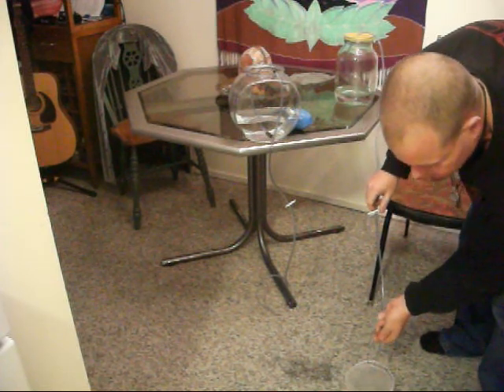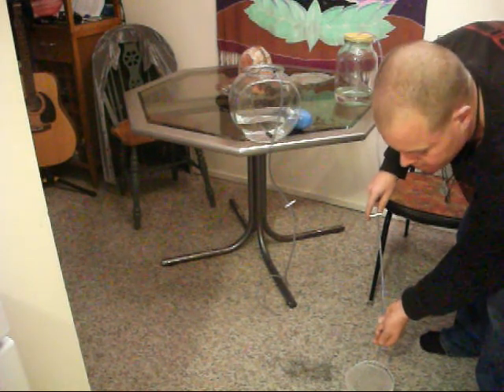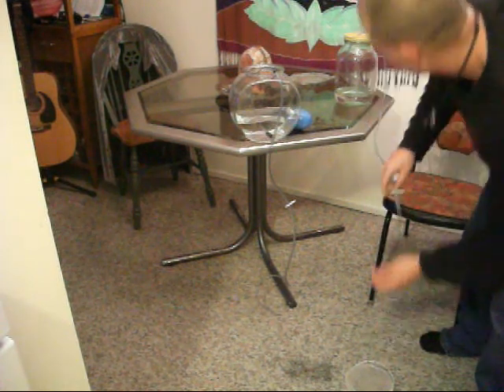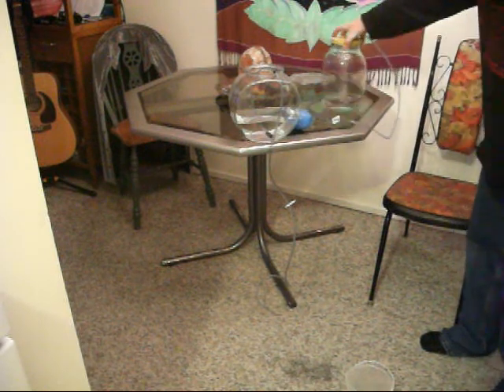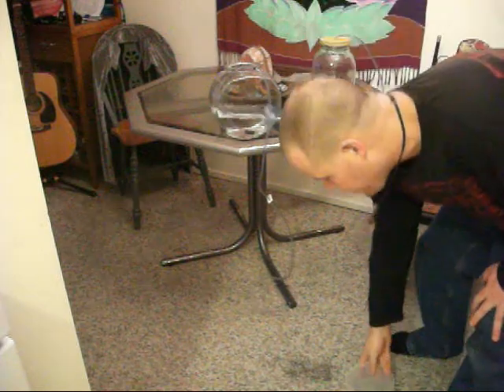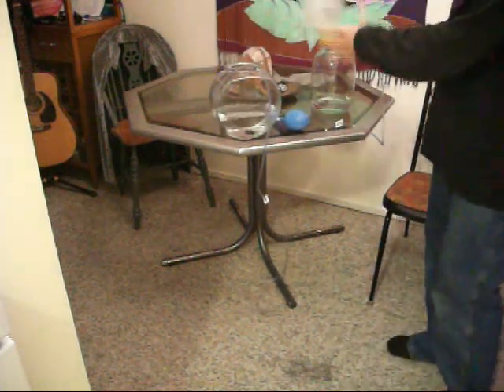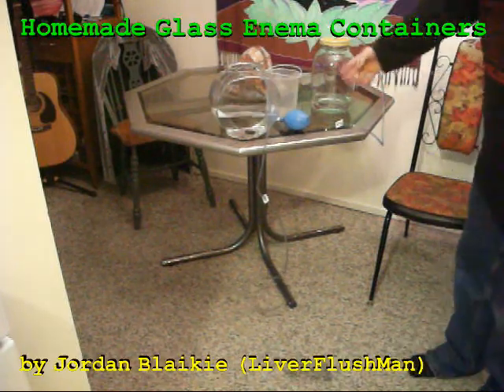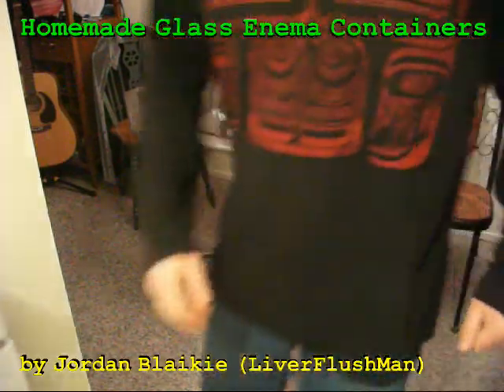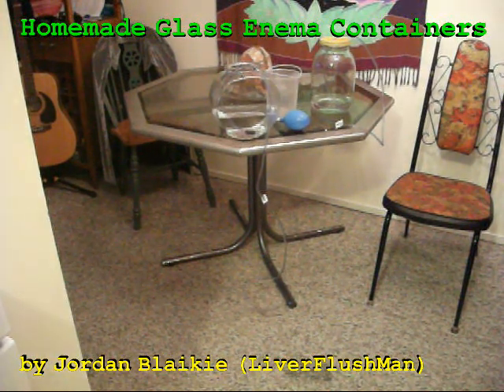And there it is. Look, you have your homemade enema made out of glass, non-toxic, for cheap, $5 to $10, and it'll last a lifetime. And awesome, man. This is the way to go, I think. You know, I mean, sure, you can buy these, but easy, for cheap and made out of glass. It's the way to go. So that's the homemade enema demonstration. I hope you like it. Thank you.